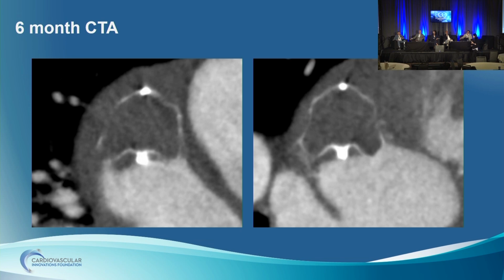Yeah, the image on the left, the frame looks very asymmetric in that cut. On the right side, it's kind of squared off, and on the other side, it really is elliptical. So I wonder if it's just a strange slice on CT or there's some motion artifact maybe on that side too. The device on the right looks very symmetrical, right? Yeah. On the left, it's very asymmetrical.